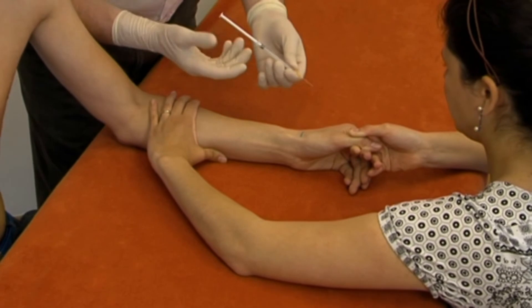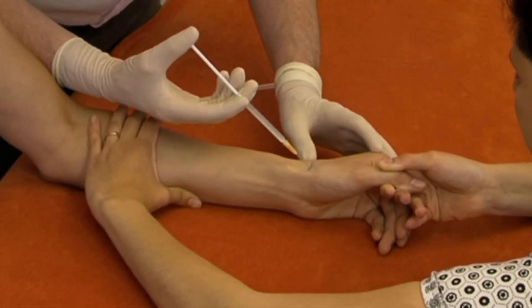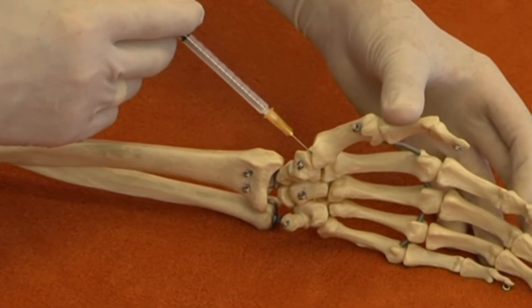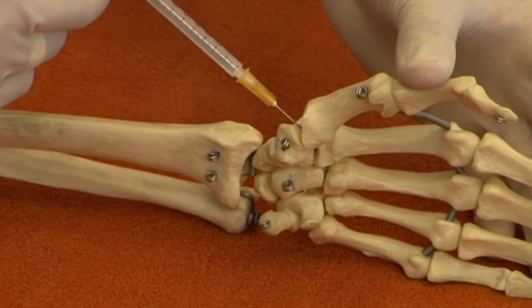The needle is directed at the open joint at an angle of 60 degrees to the horizontal plane. It hits bone at about 1 cm, then is moved about until no resistance is felt, at about 1.5 cm.